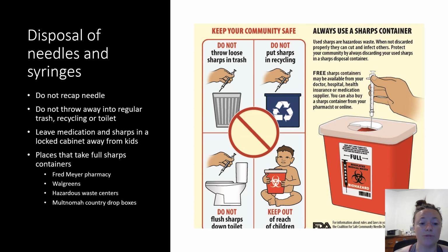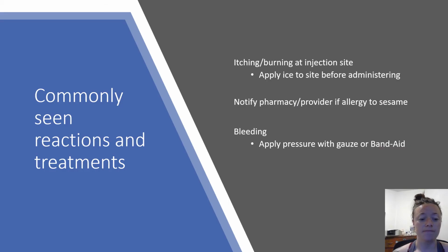Don't throw the sharps container once it's full in the trash. Don't throw it in the dumpster. You have to take those to a medical waste facility. There are places that take back full sharps containers and you can exchange them for new ones. Most pharmacies like Fred Meyer's, Walgreens. You can also call your county's hazardous waste center. Multnomah County does have needle and sharps container drop-off boxes within the city. You can go online and check out those locations.